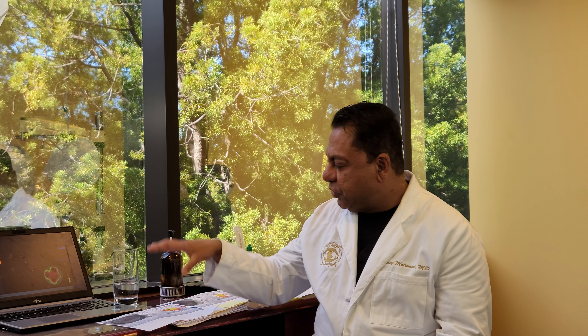Although we can make the cornea a lot smoother by using topographic guided ablation to actually segmentally laser reconstruct the cornea, when you have the top skin layer compensating and thickening and thinning to fill in the bumps and irregularity — sort of like putty or stucco — the system cannot fully get a picture of all of the irregularity of the cornea. So we have a transepithelial section as part of our treatment that actually removes the aberration the epithelium is compensating for, and then we do the topographic guided treatment.